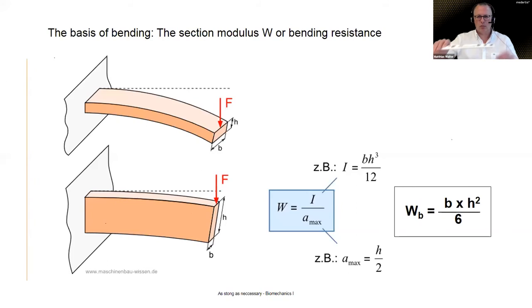When you take a ruler, for instance, and you can do this at home, you know this, right? A ruler is relatively weak when it comes to bending in the flat plane. Now, if you flip it up 90 degrees and try to do the same, it's unbelievably sturdy and stable. So it's not just the cross-section of the product that plays a role, it's how the cross-section is organized. Is it flat or is it upright? That plays a vital role. You will learn this in a minute. Okay, so those are the things that are important. Those are purely geometrical aspects, or in other words, also surgical aspects.